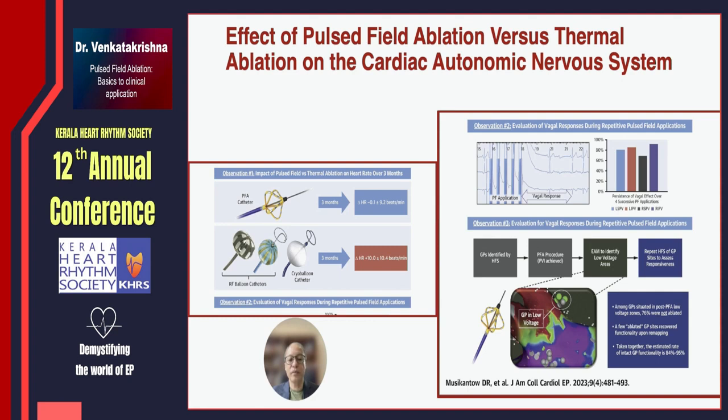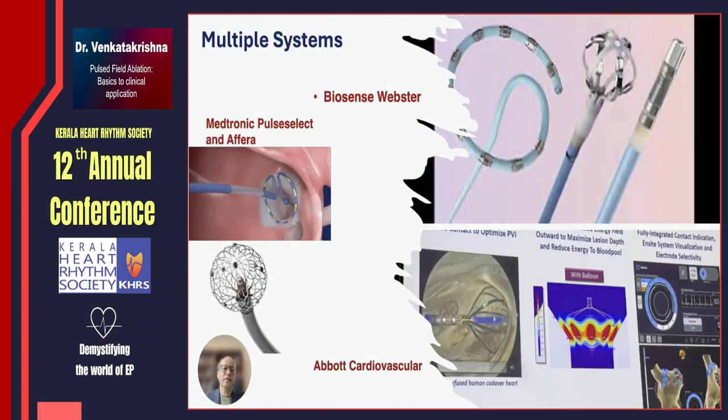and after using high frequency stimulation. But the overall, by the end of the procedure, there was a significant recovery at the end of the procedure, indicating nerve cells are less affected. So there are multiple systems that are being developed.